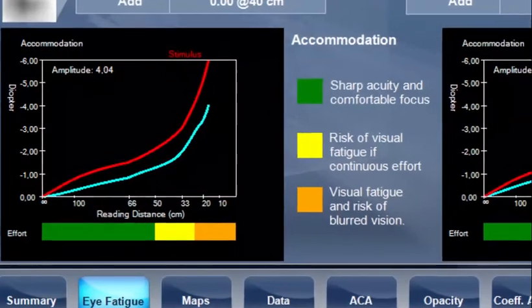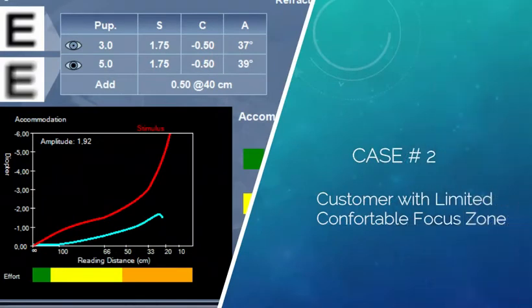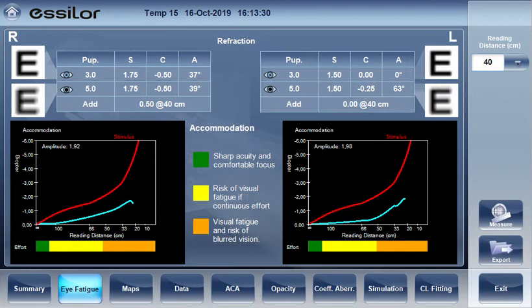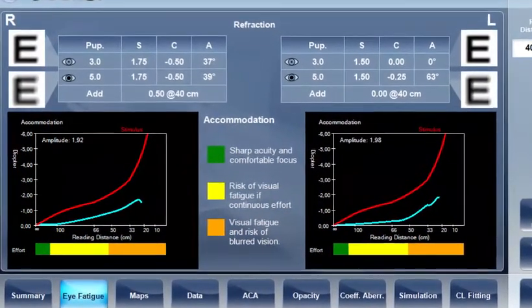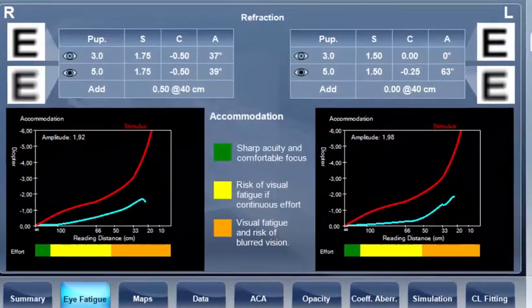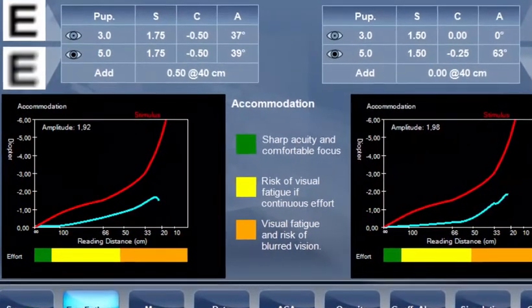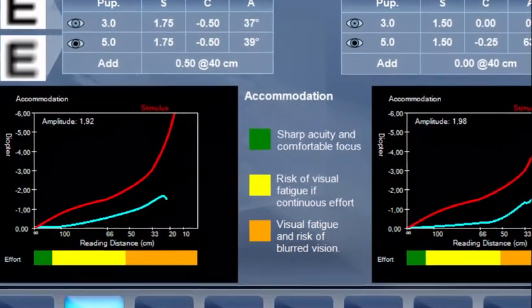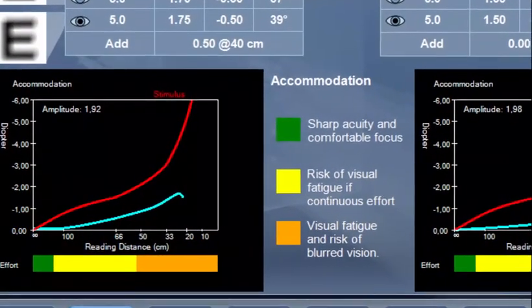This patient should be comfortable at any distance while wearing the right correction. Case two: patient with a limited comfortable focus zone. We notice a larger zone of risk of visual fatigue starting around one meter until 50 centimeters, with visual fatigue starting at 50 centimeters. This indicator of eye fatigue can help the eye care professional to start talking about the most appropriate type of lenses. This first indication must be confirmed during the subjective refraction.